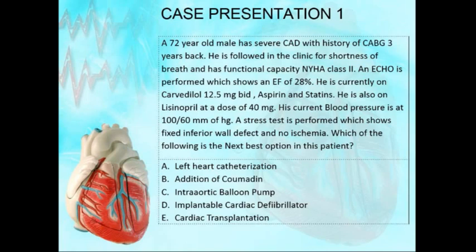What they don't want you to do is put a defibrillator on a patient who does the echocardiogram today for the first time and say, EF is low, tomorrow let's do the ICD. They don't want to do that. So what we are coming to here, a couple of things you just want to think about.